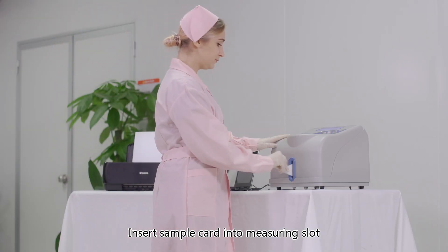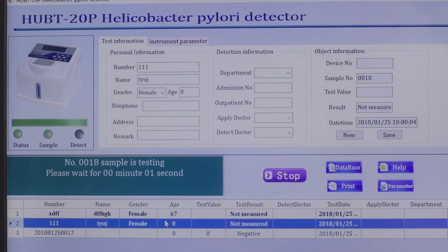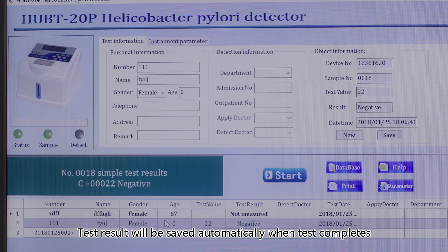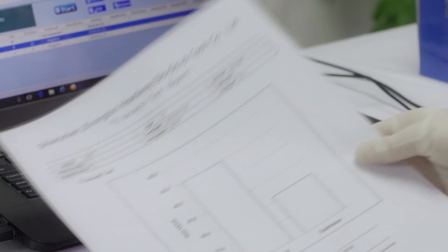Insert the sample card into the measuring slot and double-click the subject to start the test. Test results will be saved automatically when the test completes. Select the test and click 'Print' to print the test report.